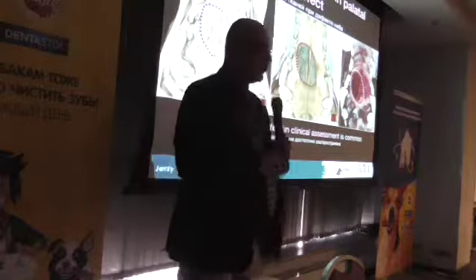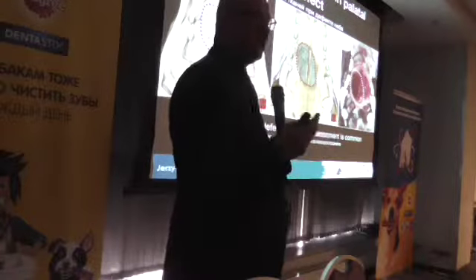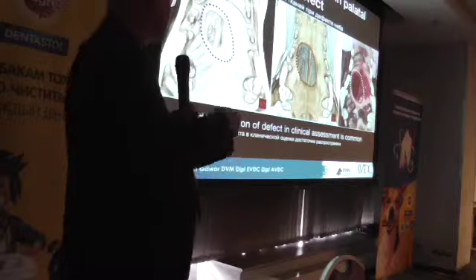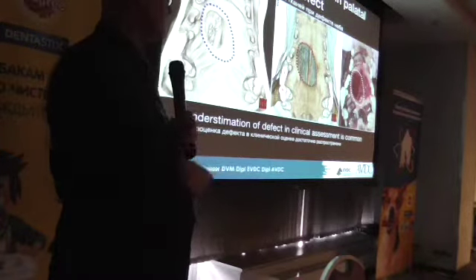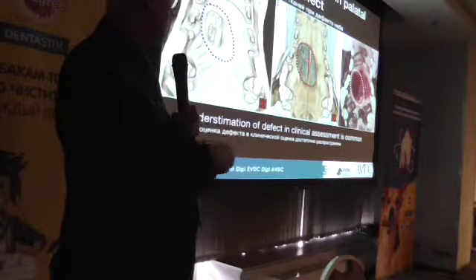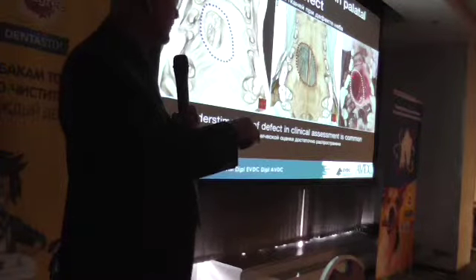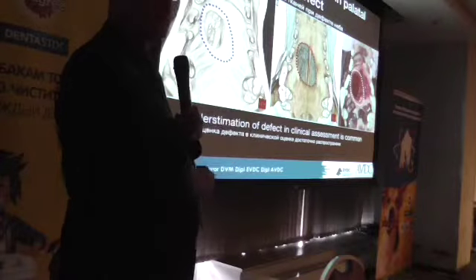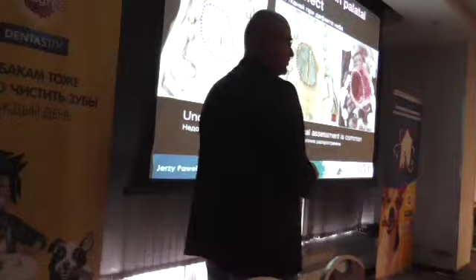Okay. One more situation, and the value of three-dimensional imaging. What we see, particularly in a palatal defect, very often underestimates the bone defect. So you see the defect of the soft tissue is way smaller than the real bone defect. That's very important for the plan of our surgery.